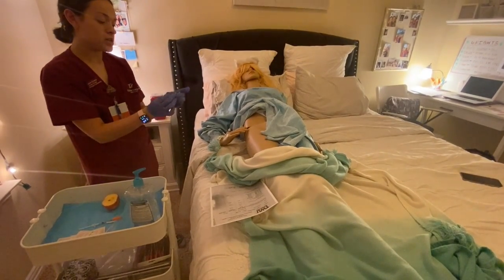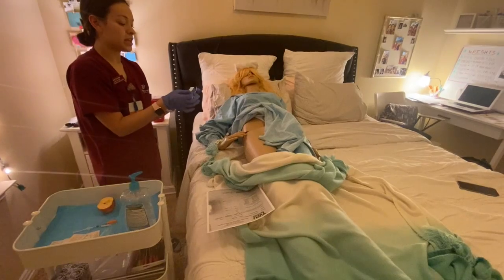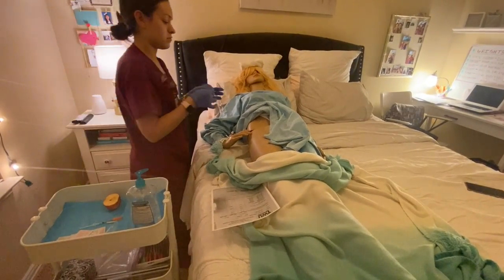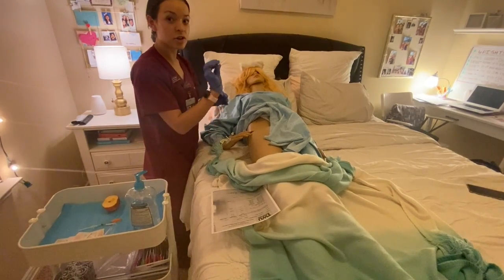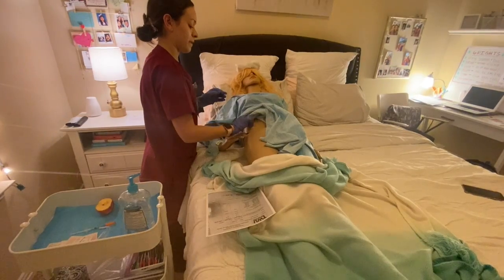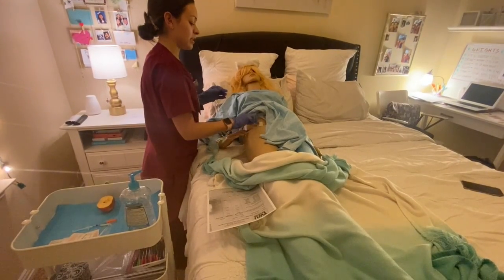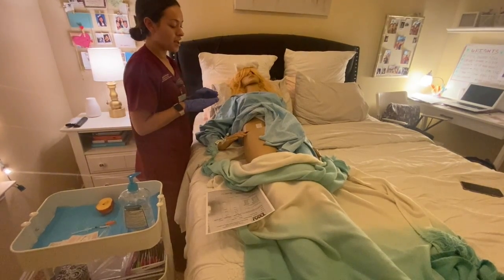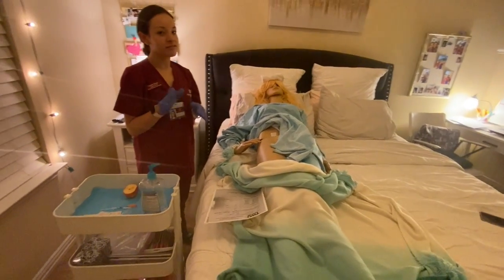I'm going to open it, and I'm going to clean the area before I inject. I'm going to go in a circular motion going in to out. And I'm just going to leave it there, that way I know that that's the right area. And I'm going to let it air dry, not fan it.